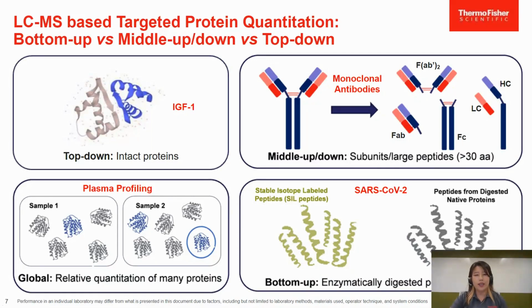I added one more approach here. This is a global profiling of your proteins. This is a relative quantification of many proteins. Here showing the plasma profiling. So you can quantify many proteins between the different sample types.